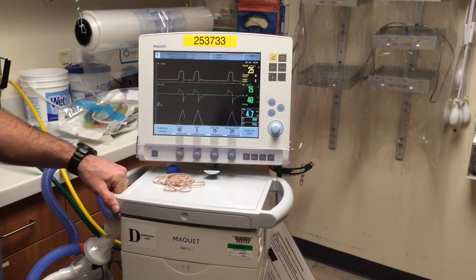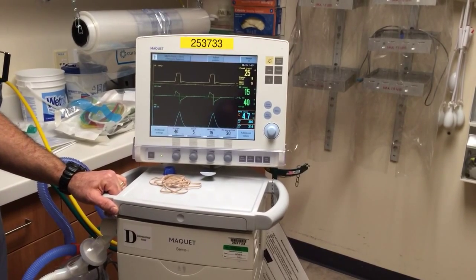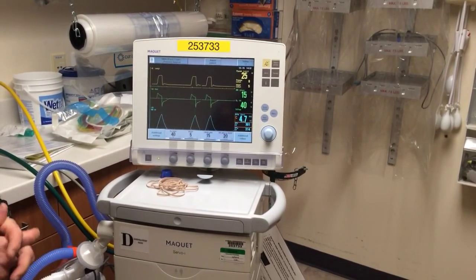We're going to cover how to set an I time without an I time order. And there's 3 steps to doing this. It's very important that you set the I time right off the bat when you first set up the vent, and we'll talk about why later. But here's the steps you go through.